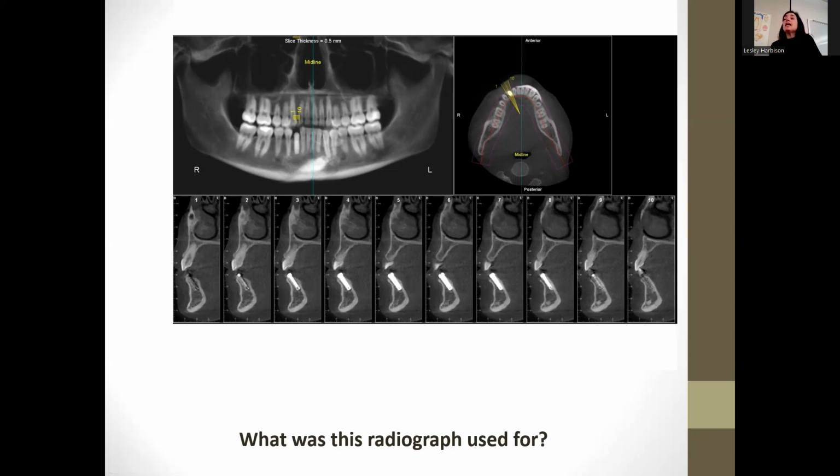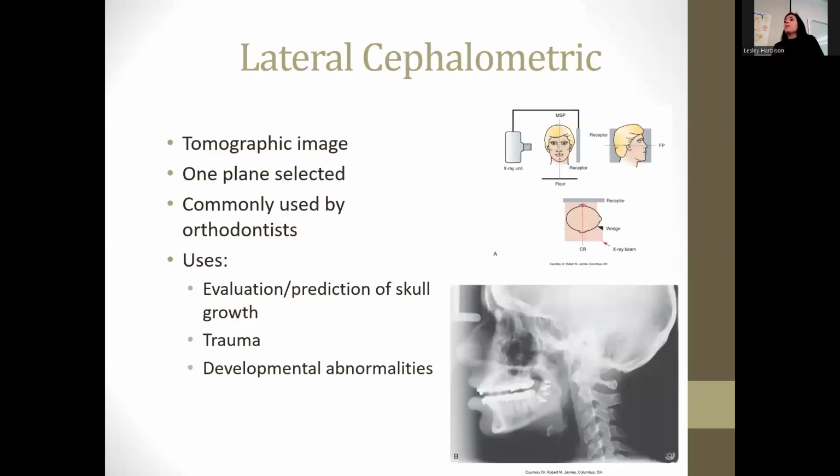Right. And they have different size implants, right? Like they can do smaller or bigger implants depending on where they are, but they still don't have a lot of room to work with. Here's just a few more examples. So now that's all for CBCT.